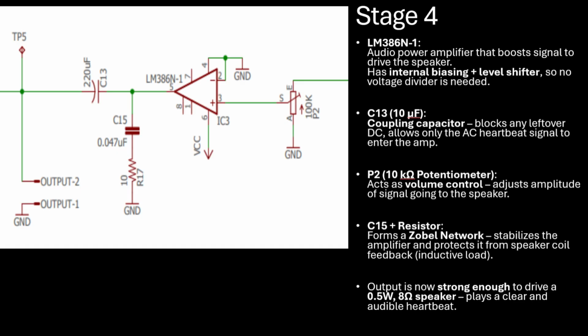At the output, there's C15, which forms a Zobel network with a resistor. This network helps stabilize the amplifier by preventing oscillations and protecting against inductive loads, which is important since we are driving a speaker. Overall, this stage turns the small amplified signal into a clear, audible heartbeat sound, completing the signal path from the microphone to your ears.